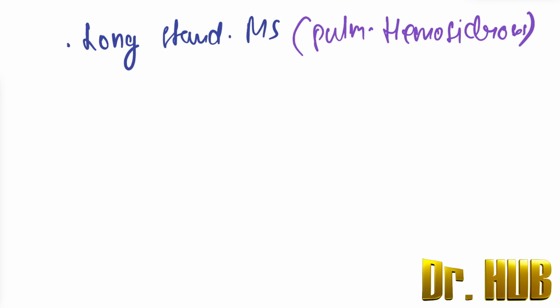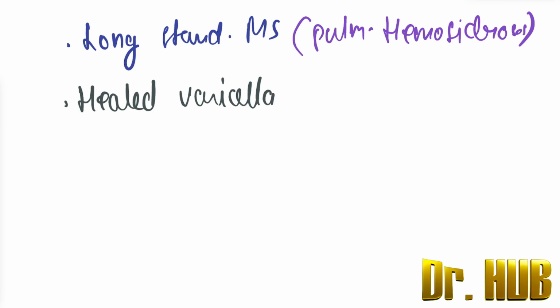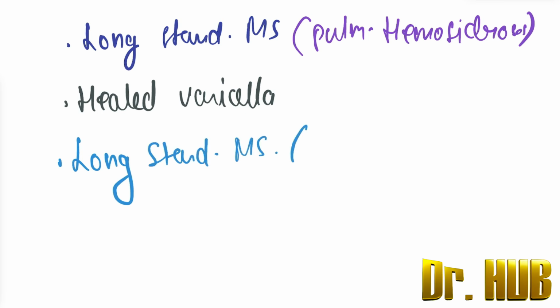Again, there is healed varicella, and then long-standing MS, which leads to pulmonary hemosiderosis.